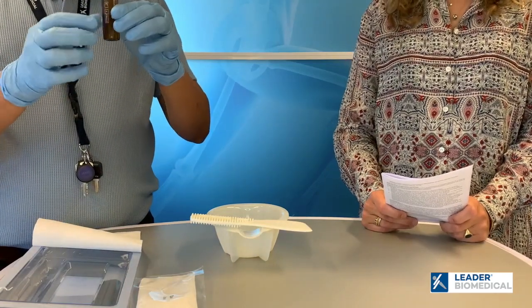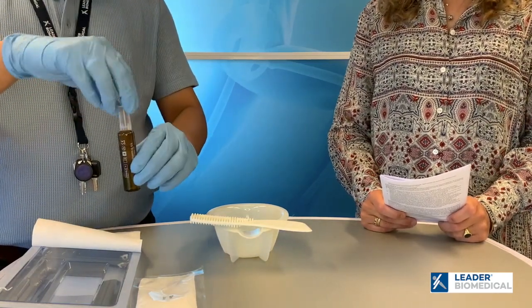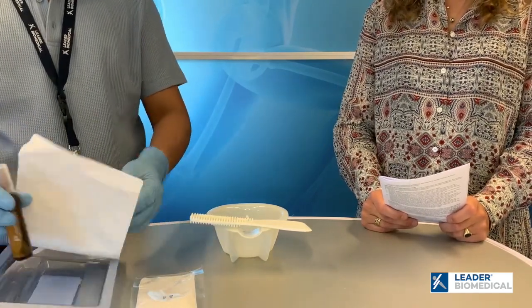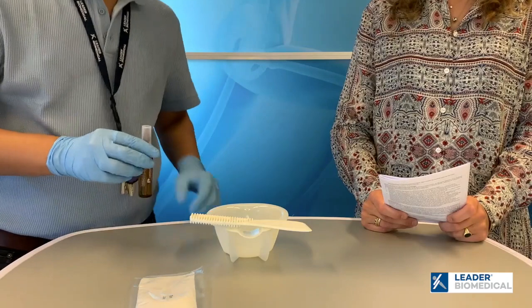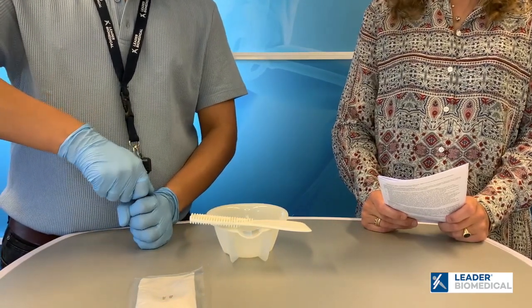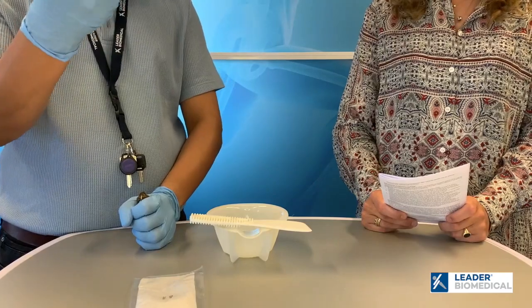The ampoule, which contains the liquid, has a safety cap which feels more secured and has less chances of glass cuts. So with some firm grip you can open the ampoule.